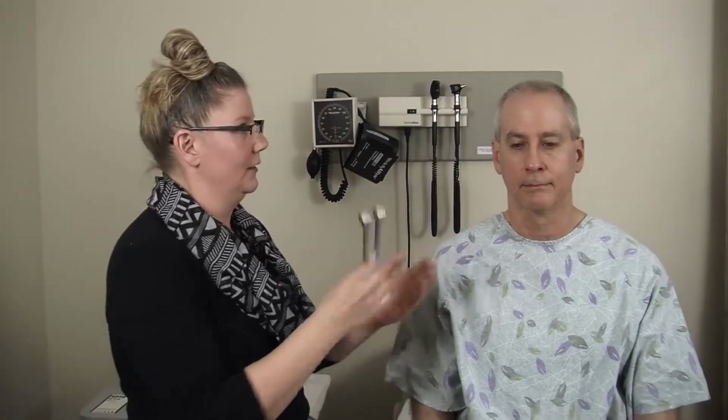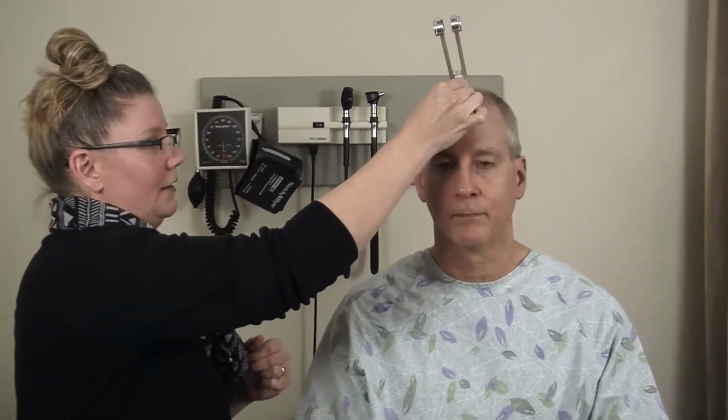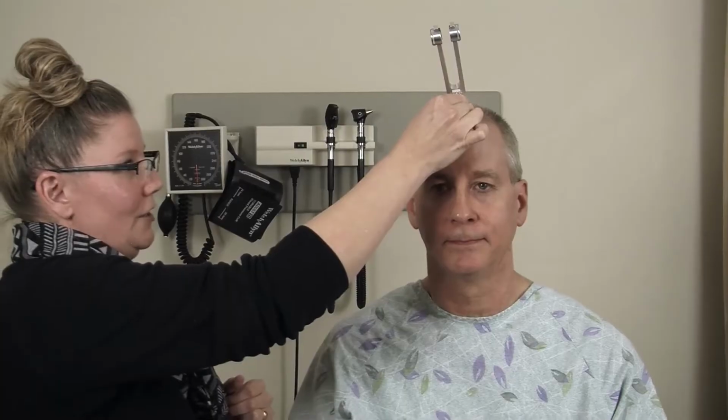And I'm going to ask him if the sound lateralizes to both sides or to the right or to the left. Both sides. Good. Both sides would be what you would expect with a normal hearing pattern.